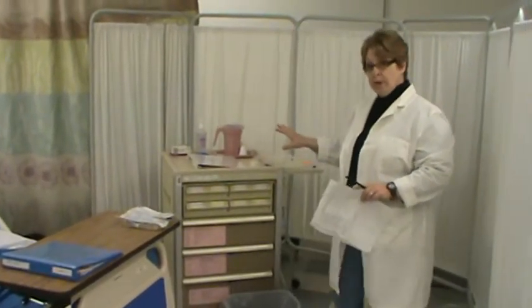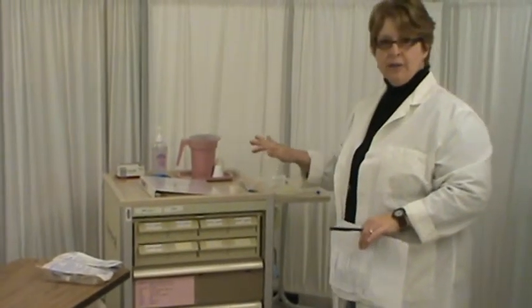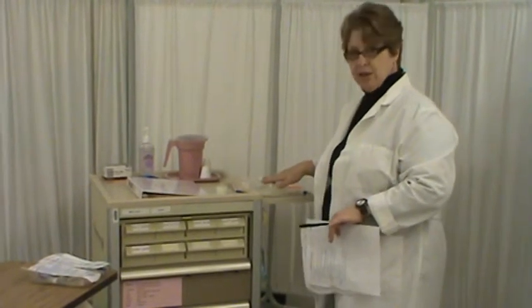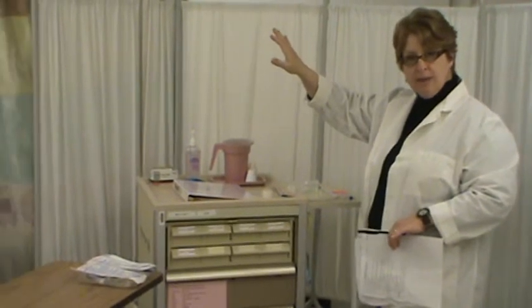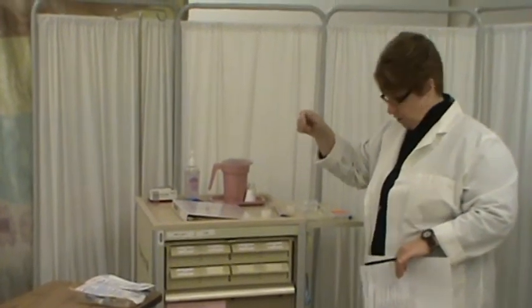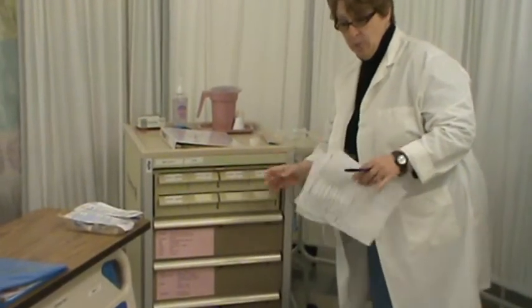In the med room is where you'll choose, after looking at the order and looking at the MAR, the proper tubing and medications. Then you'll walk over to your hooks. You'll spike your bags in proper fashion, you'll prime your tubing in proper fashion, and you'll set your rates at proper rates according to the return demo sheet.